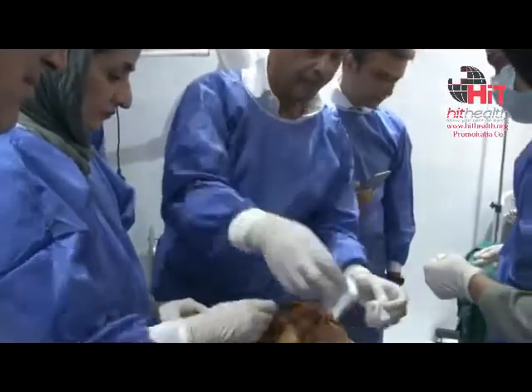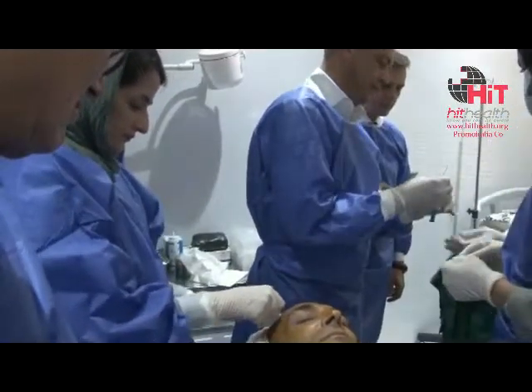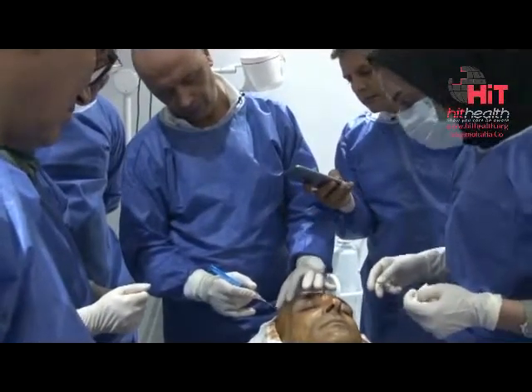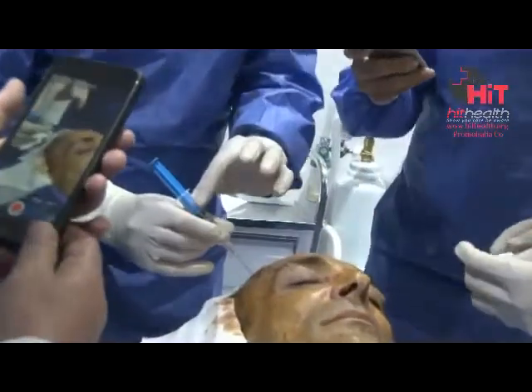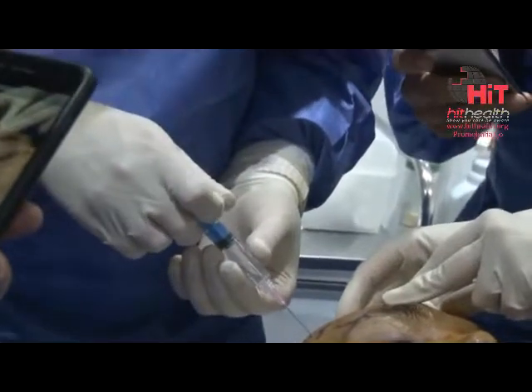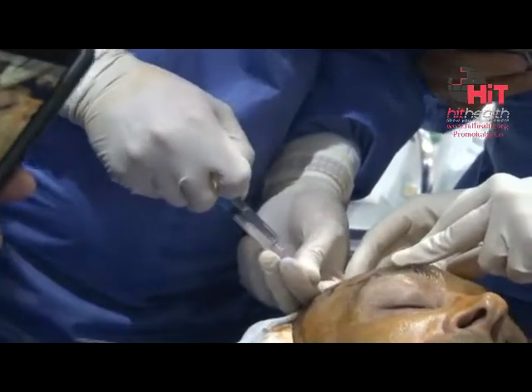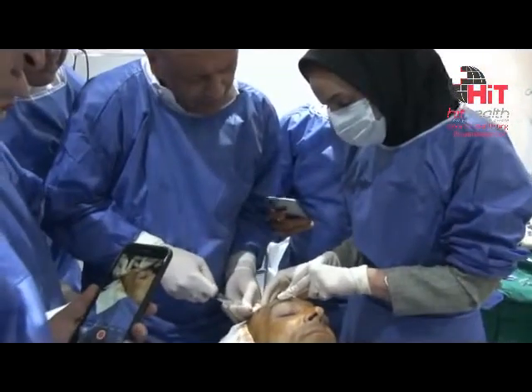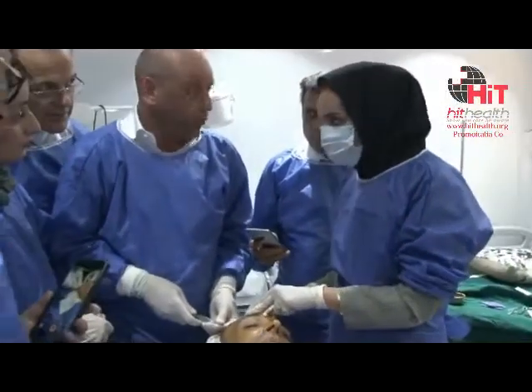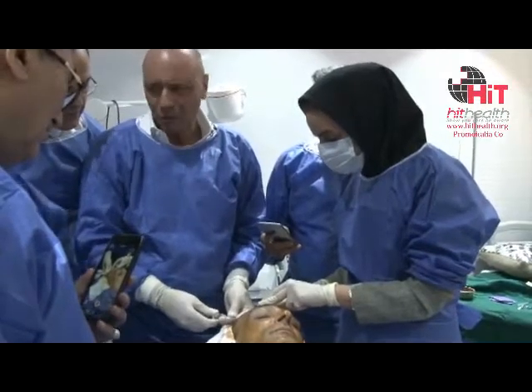Sorry Paula, please before this do the anesthesia, thank you so much, sorry. Okay, you feel this after — inject a little bit, and now you put a little bit of power and inject, power and inject, power and inject. In this way you make the first dissection. Now you stay under periosteum. I am sure I stay under periosteum because if I pull the needle, the needle doesn't move. I hope.